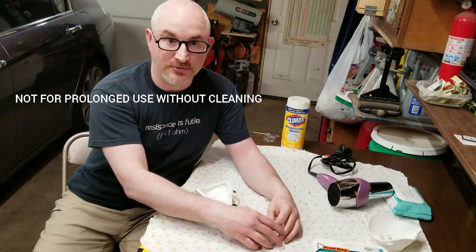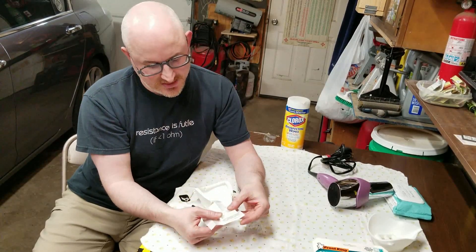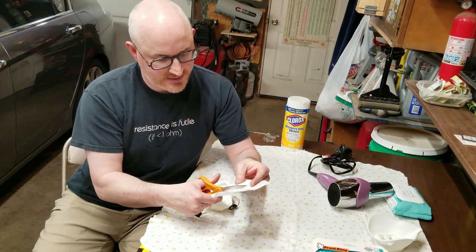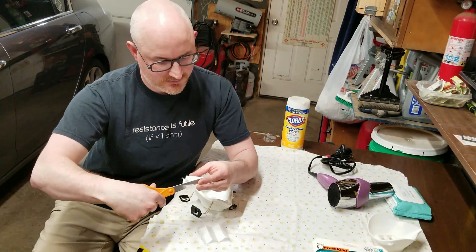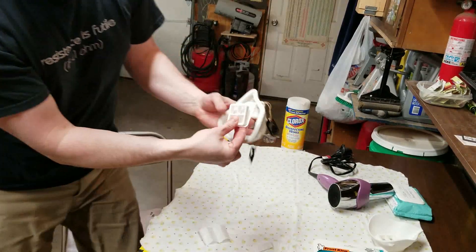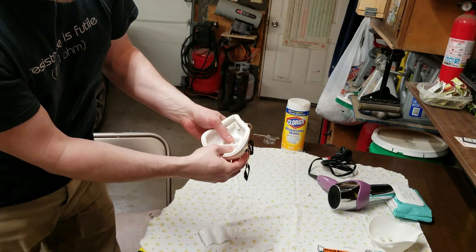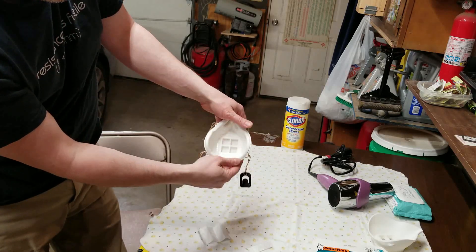The last thing to do is our filter media. What I'm going to do is cut it just a little bit bigger than the frame — not by much. Take a nice pair of sharp scissors because this filter media is not that easy to cut. Then you put it on the filter frame, kind of center it in there, and press it in.